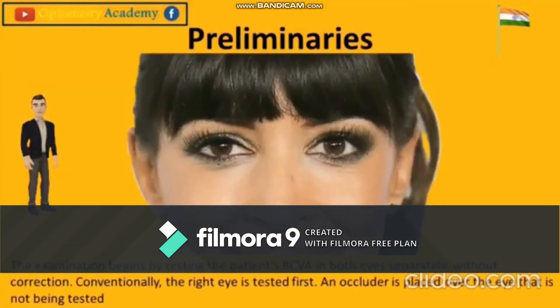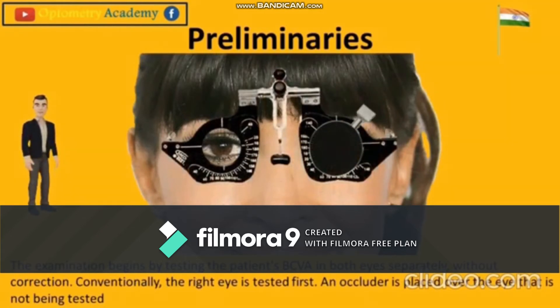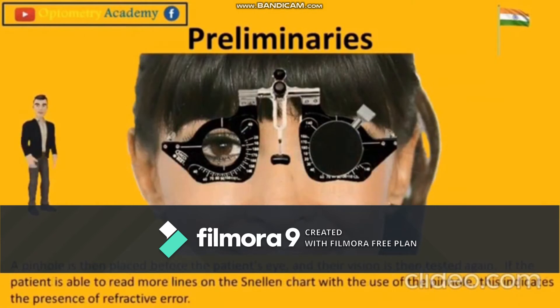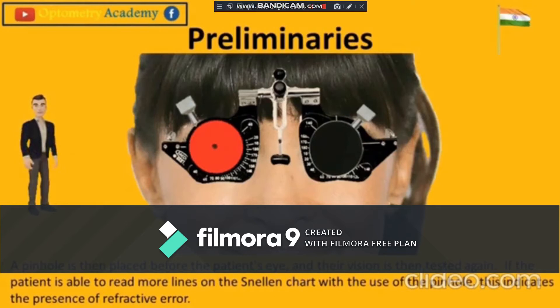The examination begins by testing the patient's best corrected visual acuity in both eyes separately without correction. Conventionally the right eye is tested first, and an occluder is placed over the eye not being tested. A pinhole is then placed before the patient's eye and visual acuity is tested again. We place the occluder over the left eye and ask the patient to read the letters they can see on the Snellen chart from top to bottom.